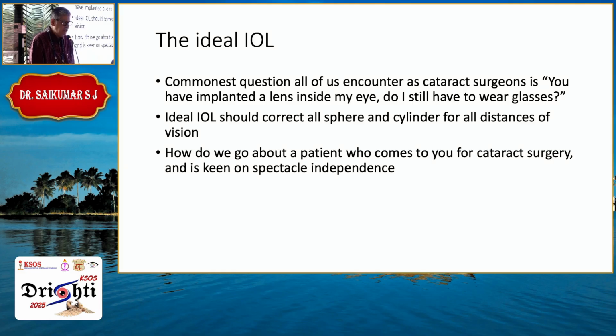So what is an ideal intraocular lens that you would like? It's a dream, utopian sort of situation where the commonest question patients ask us is, you have implanted a lens inside my eye. Do I still have to wear glasses? Even after so much counseling, people still do ask the same question. So we are not able to give a proper answer for that.